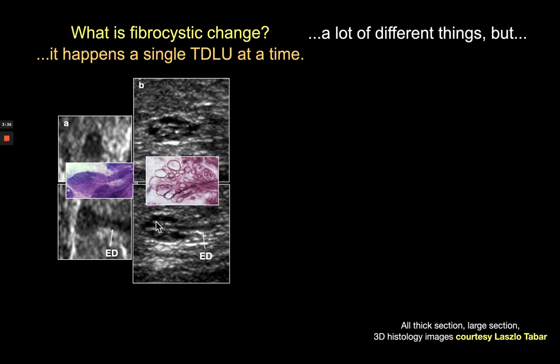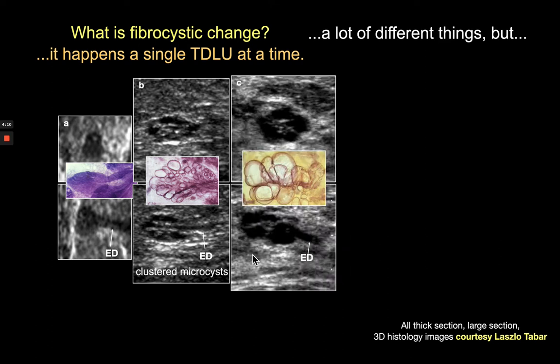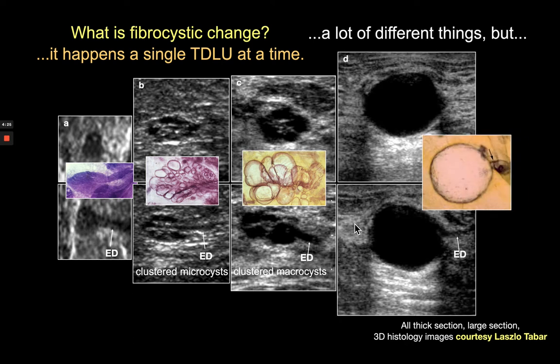In fibrocystic change, the acini begin to become cystically dilated and the walls between them eventually efface. In the long axis view, we can see seven or eight cystically dilated acini, an Extralobular Terminal Duct, and an Intralobular Terminal Duct. The normally loose gray intralobular stromal fibrous tissue has become white — the 'fibro' part of fibrocystic change. As the degree of fibrocystic change increases, the number of acini decreases and they become larger, eventually forming a simple tension cyst, usually due to twisting of the Extralobular Terminal Duct.